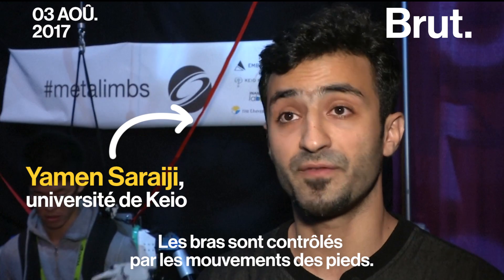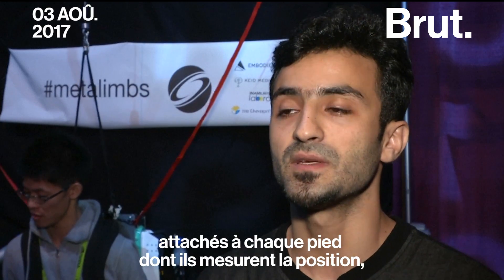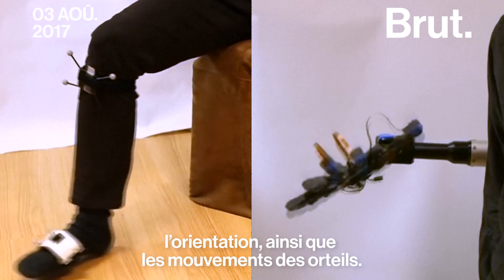The limbs are controlled by feet motion. We have a set of trackers attached to each foot, and it measures the position, orientation, as well as the toes motion.